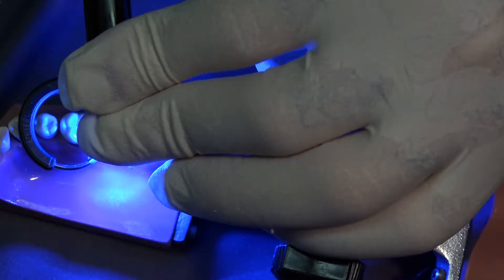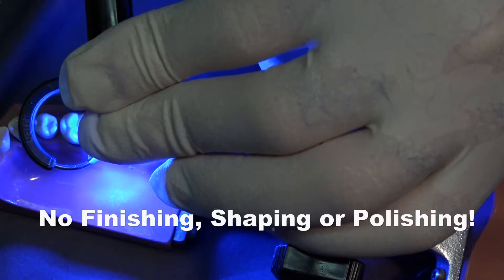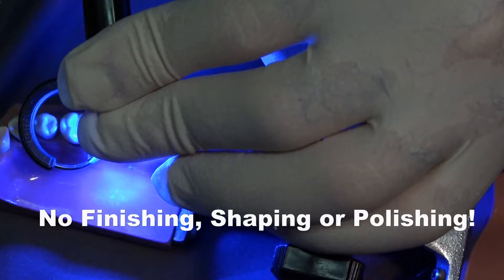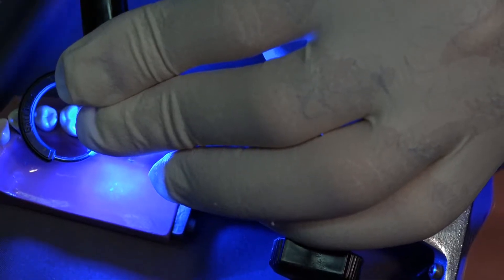If I've done this correctly, there will be no finishing, shaping, or polishing. This patient will have exactly the same contours that he or she was comfortable with when they walked in the operatory door.